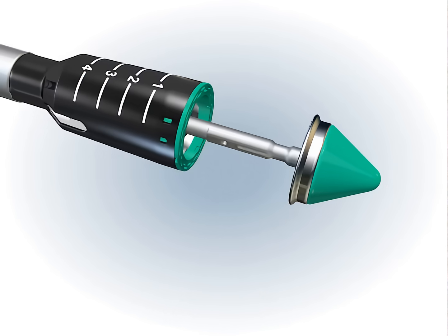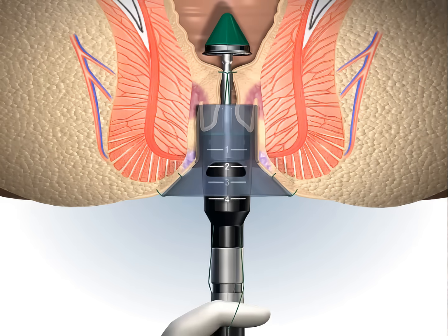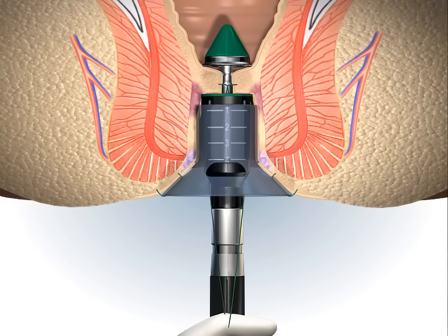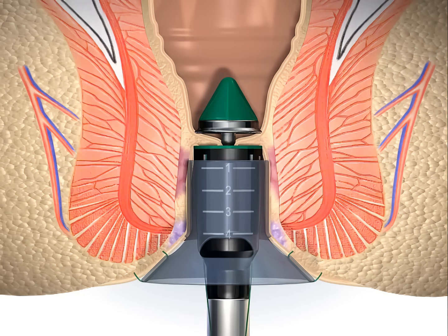The anvil is fixed to the rod to avoid accidental detachment and the stapler shaft is shorter than in conventional circular staplers. As the stapler is tightened, it is gently pushed into the anal canal while moderate traction is maintained on the purse-string so that the prolapsed mucosa begins to be drawn into the stapler casing.